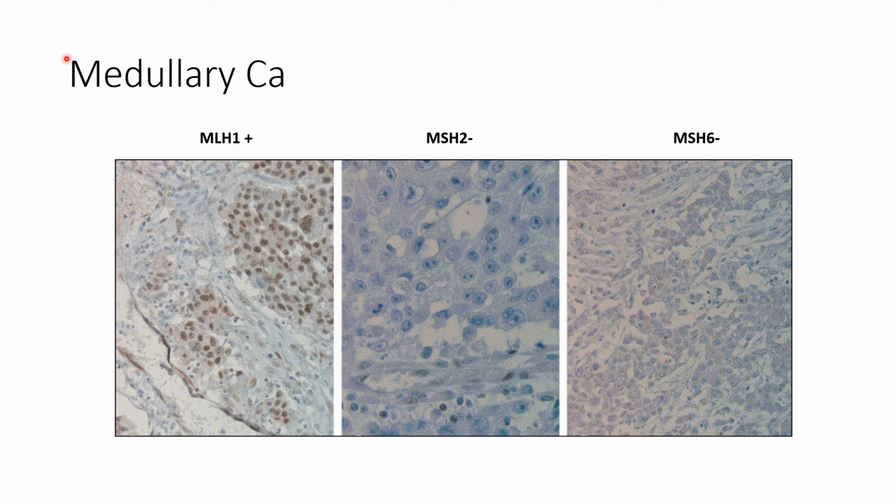And the medullary carcinoma is positive for MLH1. Here you can see the nuclear staining. Though it is not strongly positive, it is still positive for MLH1, showing nuclear positivity, but MSH2 and MSH6 are negative in medullary carcinoma.